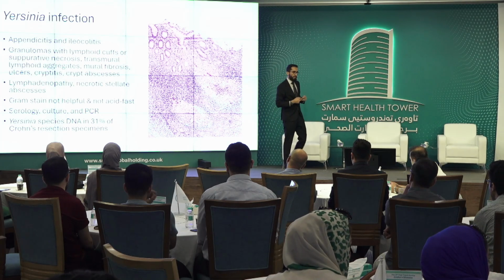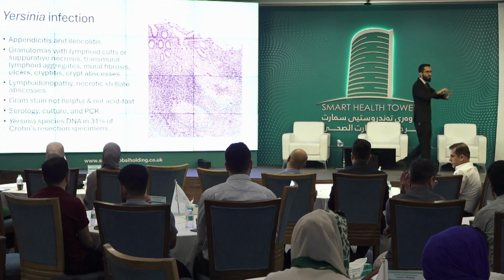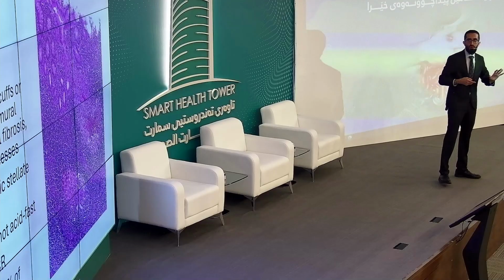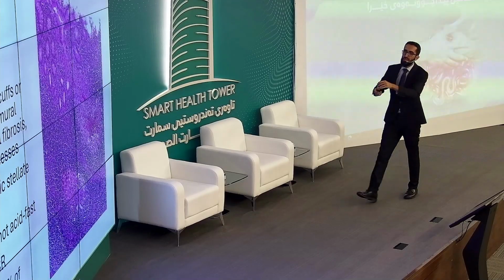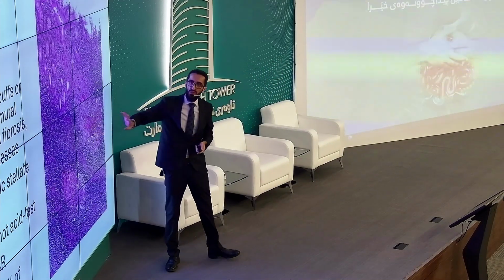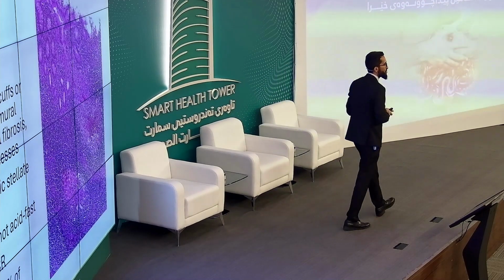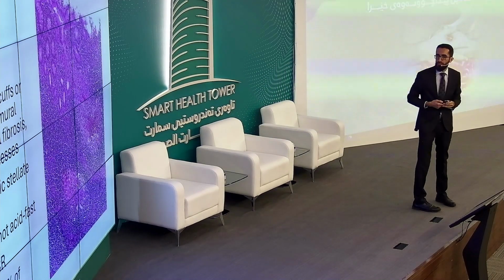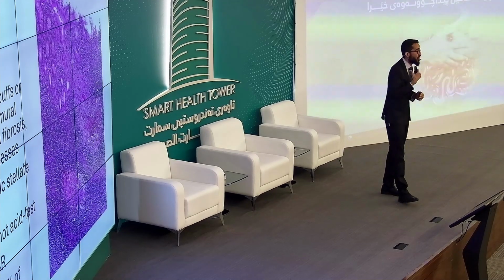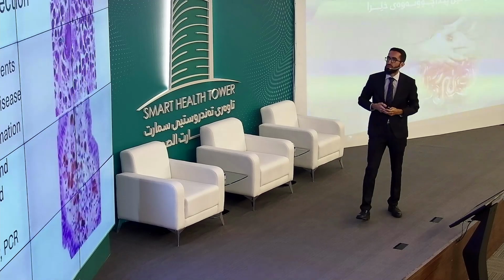Regarding Yersinia, this is also one of the mimics of Crohn's disease because it can have all of the histologic features of Crohn's. It can have granulomas. The granulomas are usually suppurative, meaning that there is neutrophilic inflammation within them. So it's important to keep this in mind, especially if you have appendiceal involvement, to do the culture and the PCR or the serology for it. It is suggested to be one of the pathogenic causes of Crohn's disease, as in one study it was found in about 30% of patients.